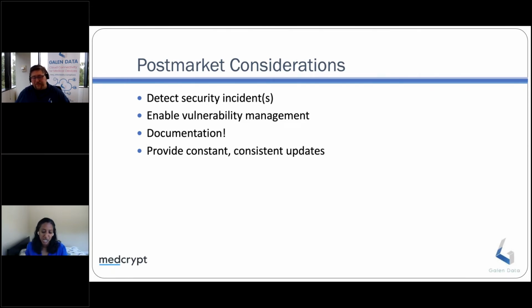So this idea of has this really happened, right? You alluded to the fact that you don't know if it really got exploited or not. This is a real challenge in our industry because we're not looking for this data. If you ask the FDA objectively today, show me a body associated with a cybersecurity event, they will say it has not occurred. But the reality is when these people get rerouted because they can't deliver care, or when there's a delay in getting an MRI, you perhaps have a suboptimal outcome for a patient. These things actually have ramifications for clinical outcomes. We just don't have the data to justify it.